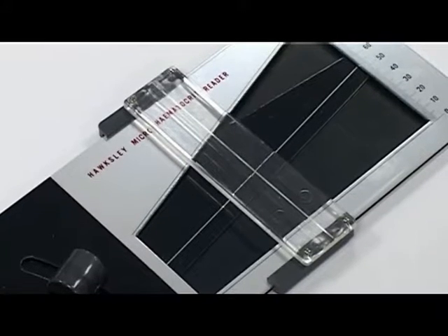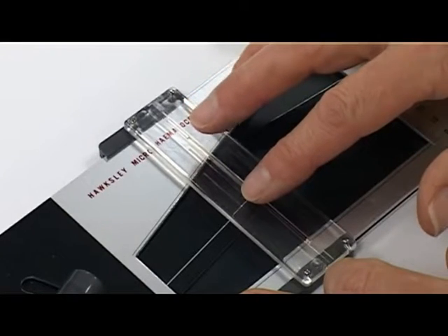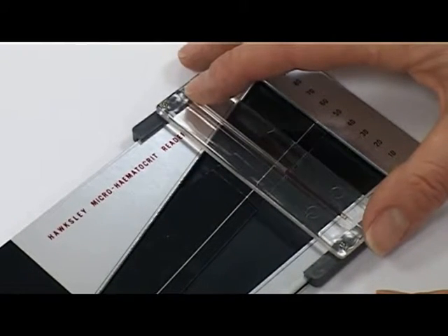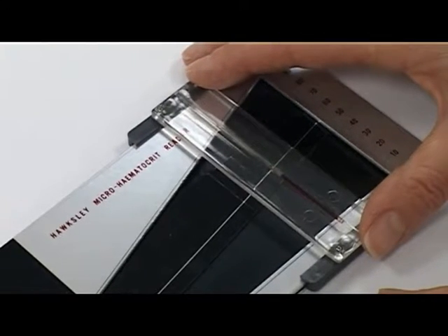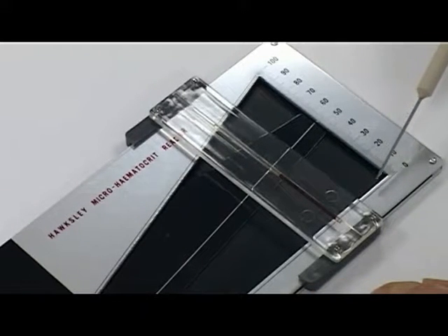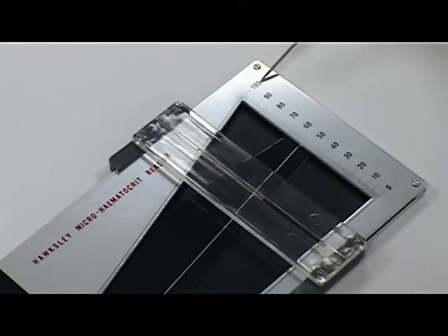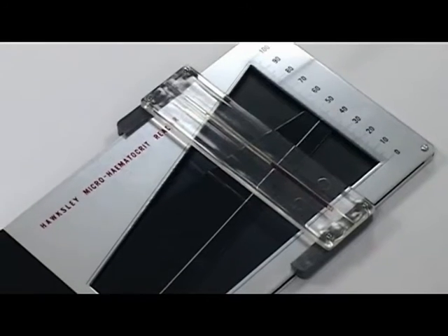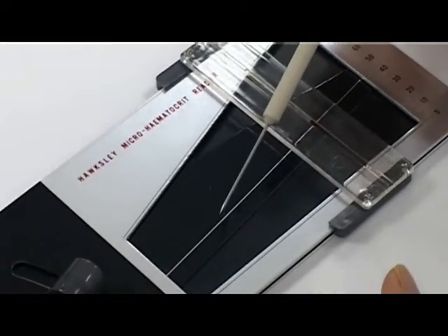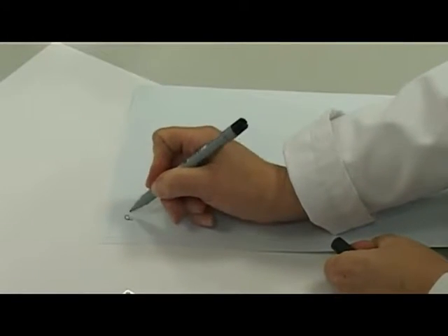Place a prepared capillary tube into the PCV reader with the sealed end at the bottom. Ensure the bottom of the red blood cell layer is at the zero line of the reader. Move the adjustable PCV reading line to intersect with the top of the red blood cell layer. Record the PCV result correctly as a percentage. In this example, it reads 45%.